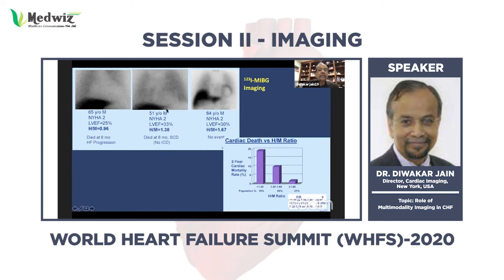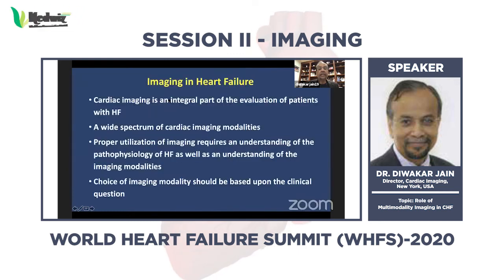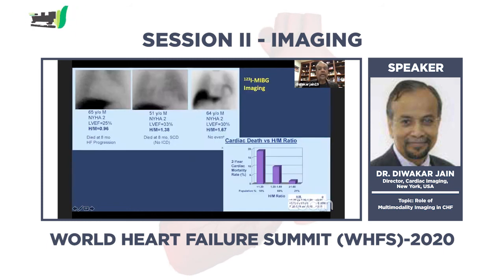Yet another patient, ejection fraction is 33%, but we can see there is very little radiotracer uptake in the heart. His heart to mediastinal ratio is 1.38, and that is significantly abnormal. He died of sudden cardiac death 8 months after the study was done.